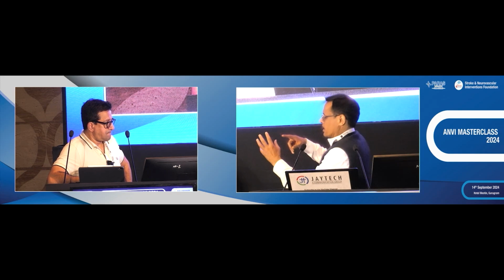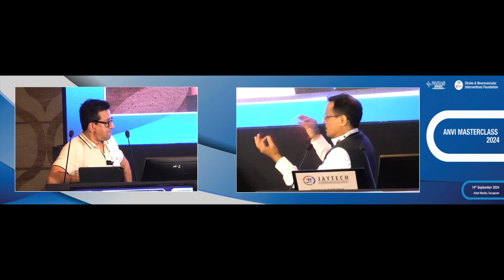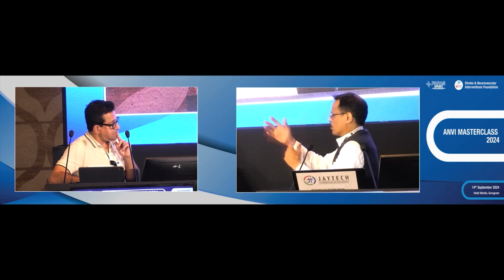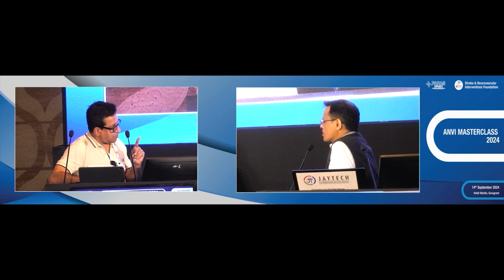You showed a case like a reverse pointing ACOM, your microcatheter hitting the wall, and then delivering a device. And I find that very uncomfortable at times. I've done it. So how do you manipulate in that circumstance? You showed it very well, that you push out the device and then it repositions itself. Just go over that in 1 or 2 minutes. So when the microcatheter is pointing forward, how do you get the device into position, whether it's WEB or Contour? Yeah, so I think WEB is very difficult in that location.